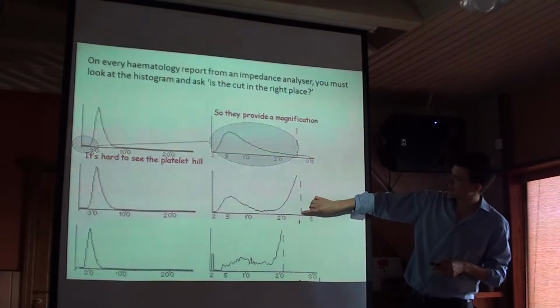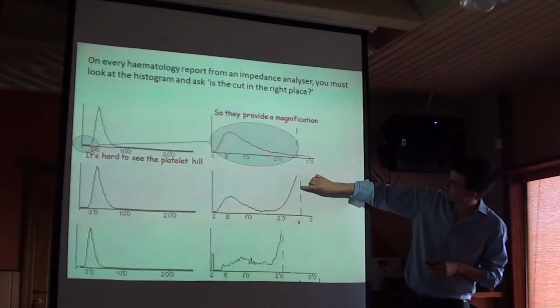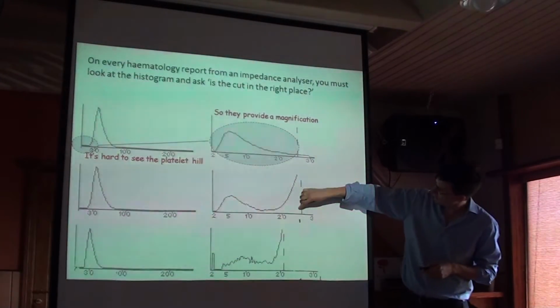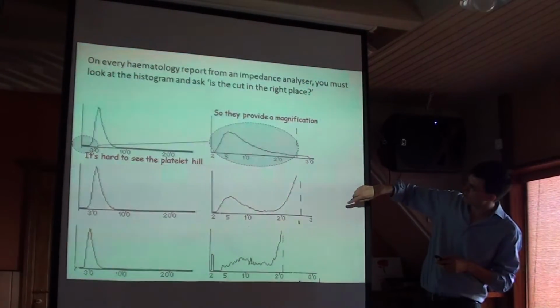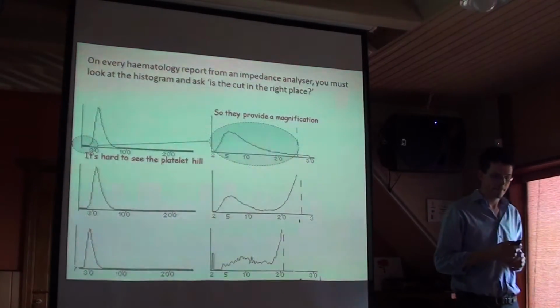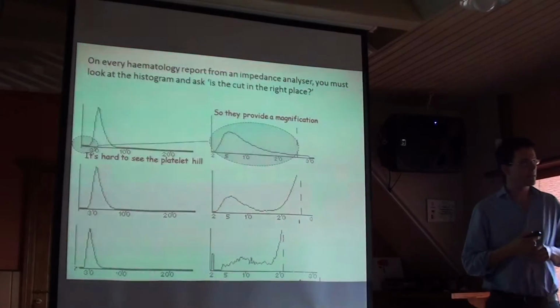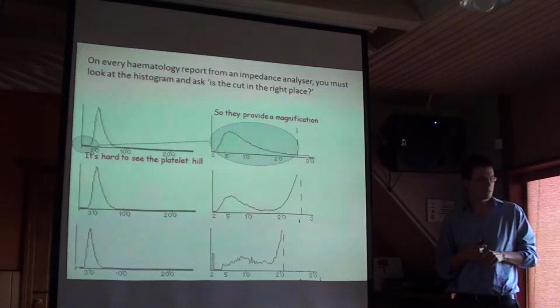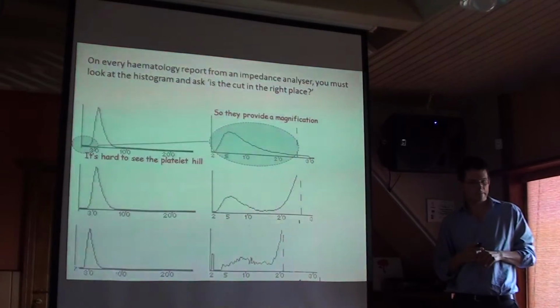Exactly, overcounted. Here is the line where the analyzer thinks that the platelets start and the red blood cells are on this side. You can see the line has missed the value. Et tegelikult siis masin on tõmmanud selle eristusjoone valesse kohta, et see eristusjoon peaks olema seal, kus on org kahe künka vahel.